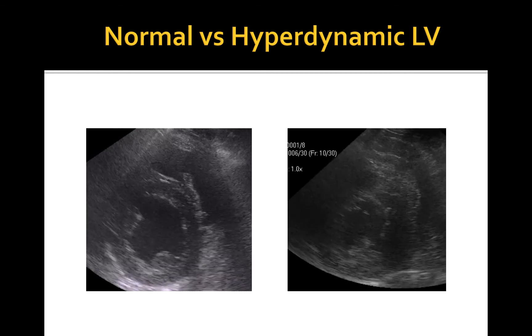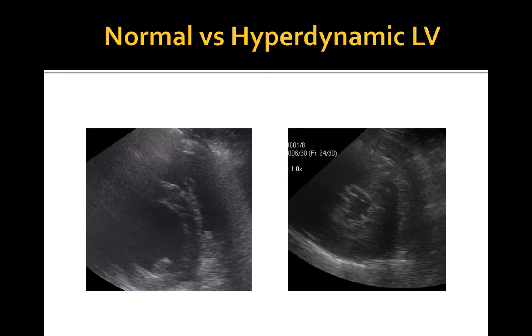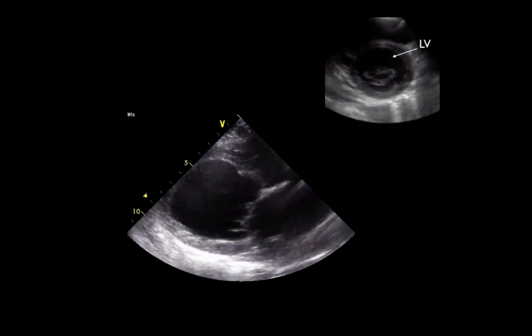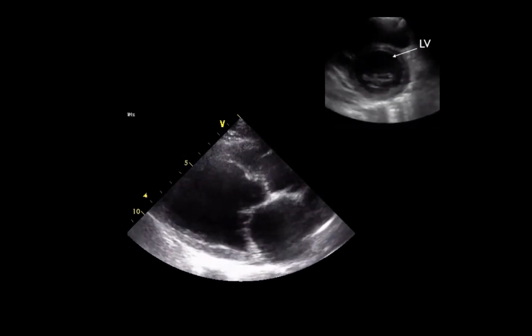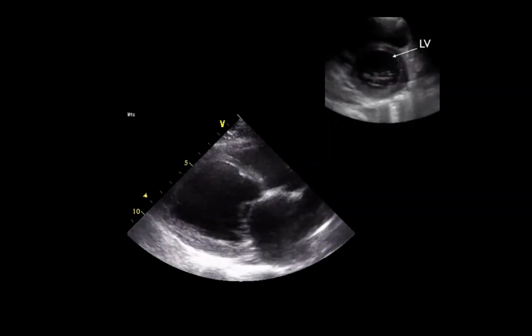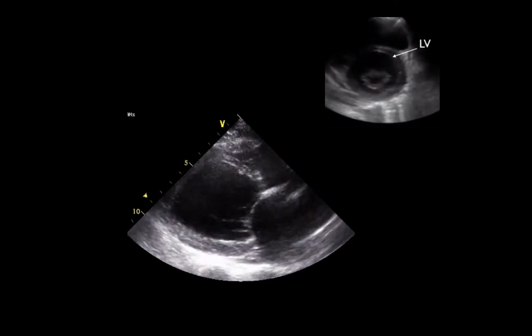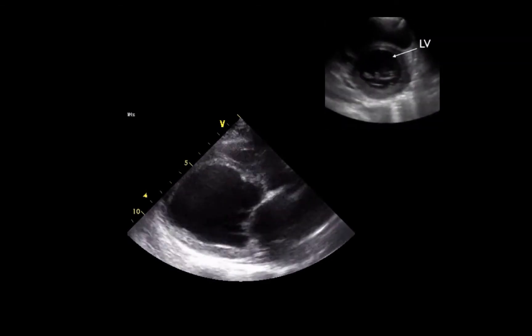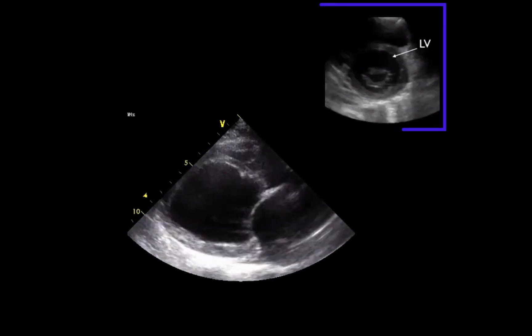To the left, you can see the left ventricle with normal contractility and to the right, a hyperdynamic left ventricle. This is an example of the hypodynamic heart. The video clip in the center represents a right parasternal long axis view. If you look at this heart, there is minimal endocardial excursion towards the center of the LV. The interventricular septum and free LV wall don't get thicker during contraction. Finally, the anterior mitral leaflet is barely moving, resulting in a huge distance between the leaflet and the interventricular septum at the end of diastole. Based on this eyeball assessment, we can confidently conclude that this dog's LV function is hypodynamic.